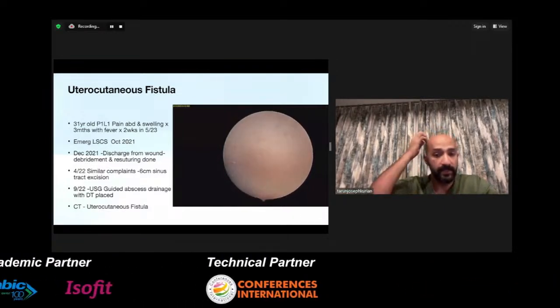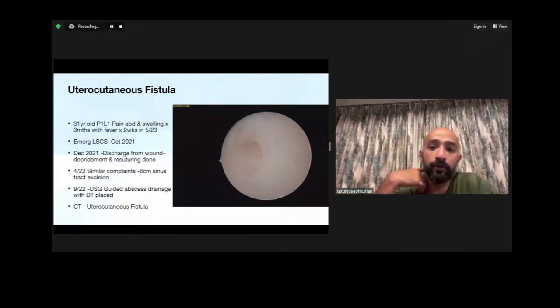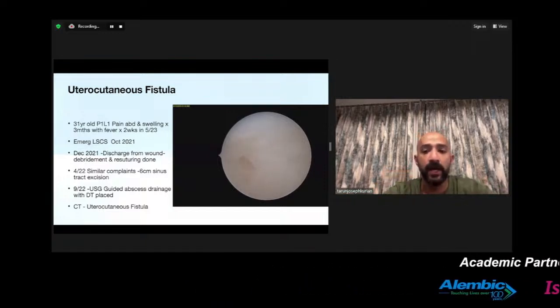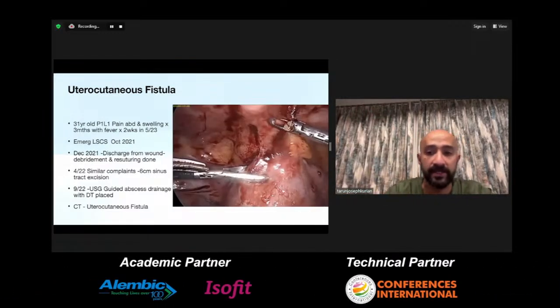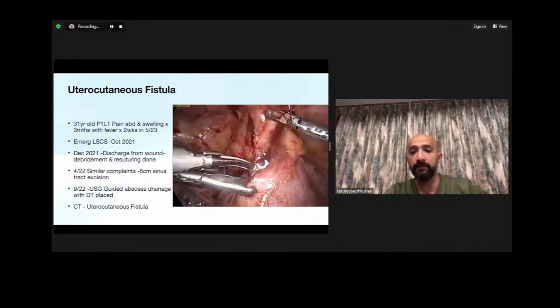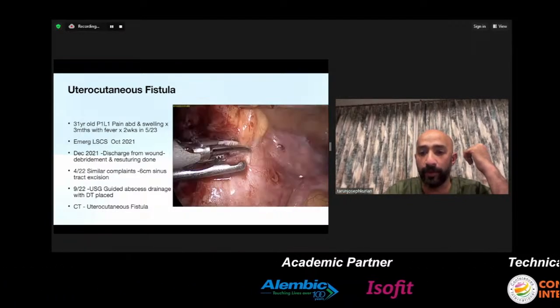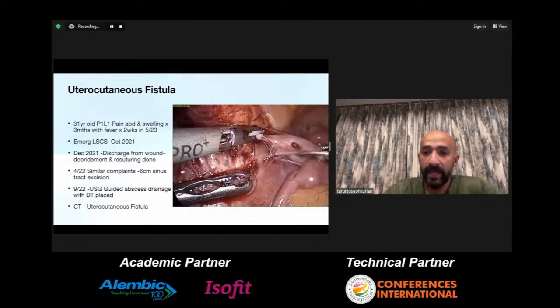You could see both the ostia quite clearly. As we withdrew, we found one point at which there was a connecting cavity above. You can see the bubble sign of the fluid traveling, showing your patent tract above. So we went above, and as you can see, this uterus also was slightly pulled up, though not very badly pulled up.